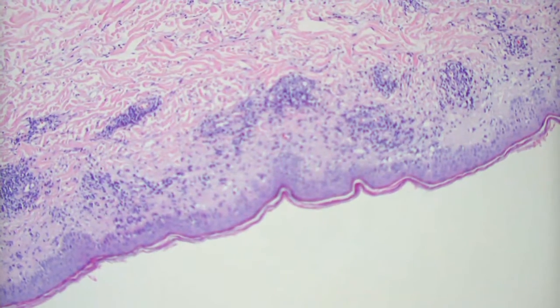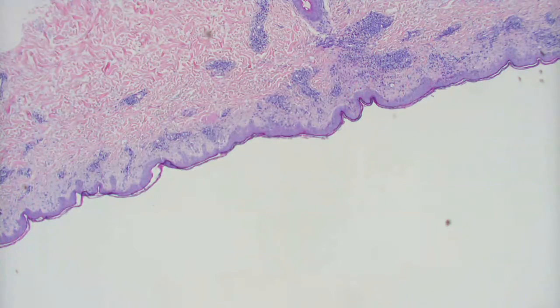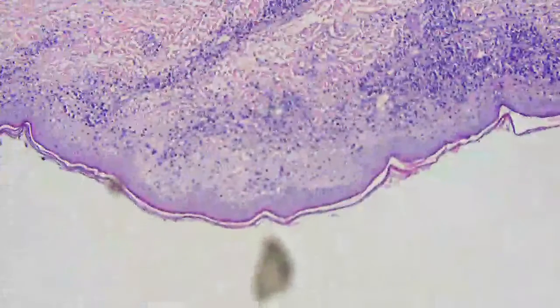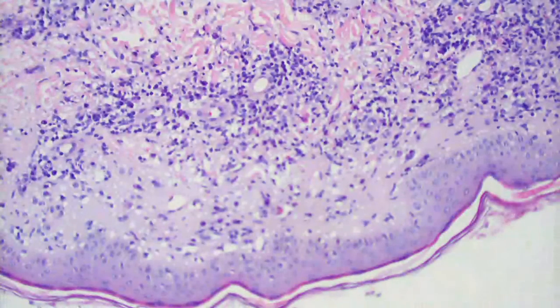Okay, well, those are reasonable. So if you look at the pattern at low power, we don't have the base of the biopsy, unfortunately, but superficial and certainly mid, maybe possibly deep, but we don't know because we don't have a deeper biopsy. It's got kind of a band-like infiltrate of lymphocytes, plasma cells, and also some histiocytes. There may be a little focal, not really well-defined granulomatous inflammation, but no sarcoidal granulomas. Syphilis, when it is granulomatous, usually is not dense sarcoidal granulomas. It can be, but it's not real common. But tons of plasma cells.